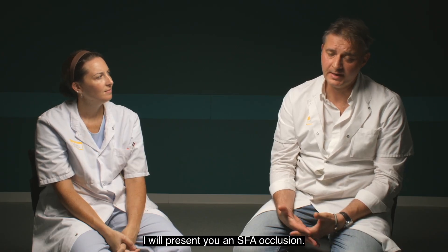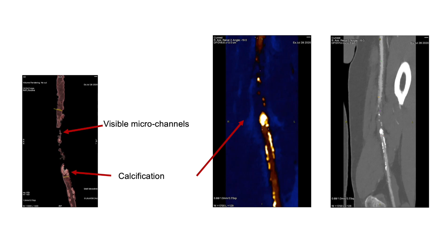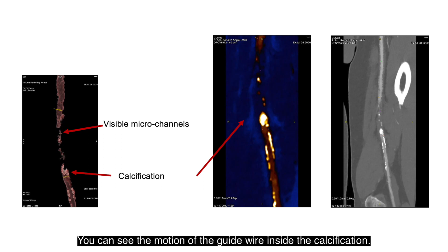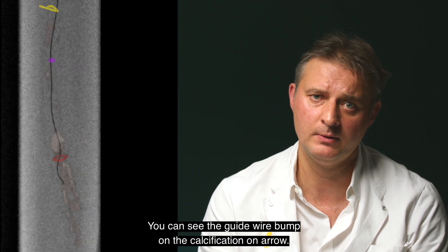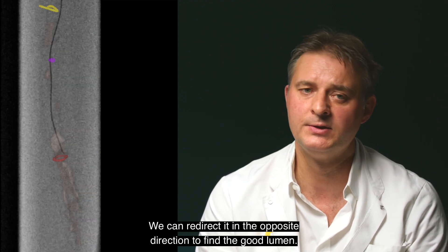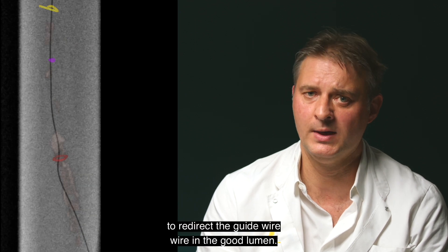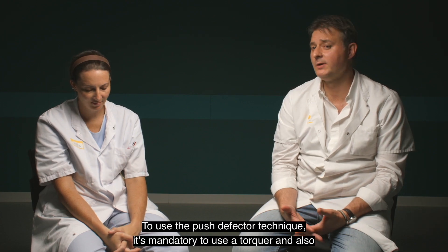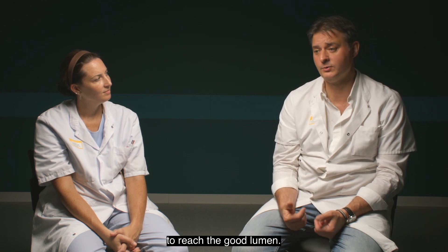I will present an SFA occlusion case. It's not a very long occlusion, but the challenging part is a very calcified distal cap. I decided to use an Halberd .018 guide wire to apply the push-deflector technique. You can see the motion of the guide wire inside the calcification — it bumps on the calcification, and on each rotation we redirect it in the opposite direction to find the true lumen. We always use both hands to redirect the guide wire. It is mandatory to use a torque device and a microcatheter support to increase the ability of the guide wire tip to perform the correct motion.